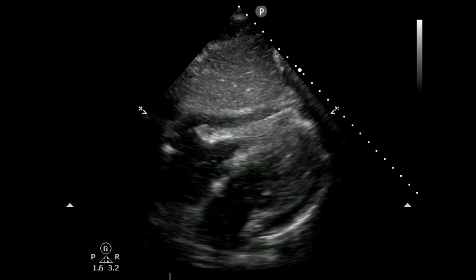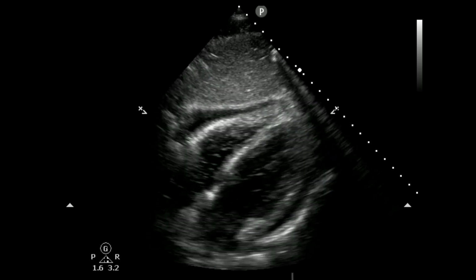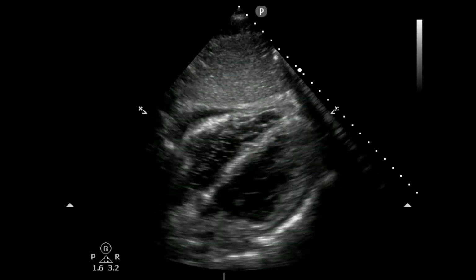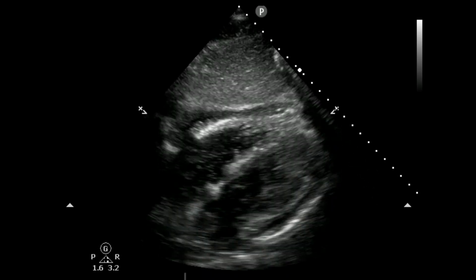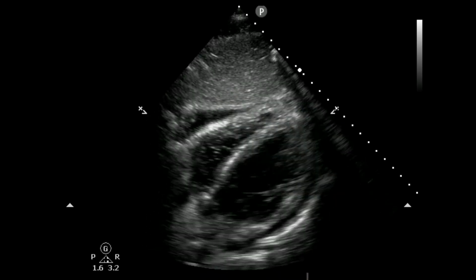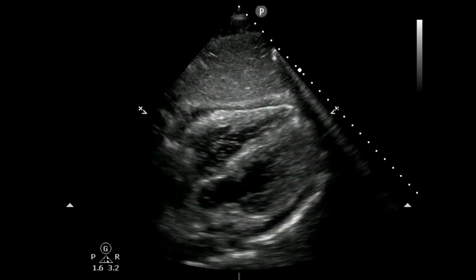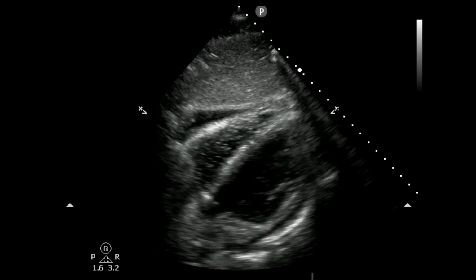And the goal is to find that, stop and fix that to the best I can before I move on, and then identify the fact that they got their pinky toe fractured as a result of whatever their trauma might happen to be. In this setting, we generally tend to think of massive exsanguination as the major one, but then all of the obstructive phenomena, right? If you have a tension pneumothorax or a tension hemothorax or a pericardial tamponade, those are big things that need massive drainage early on in the patient's trauma resuscitation. That's going to have a massive impact on their mortality and their morbidity. And so these are things I need to identify.